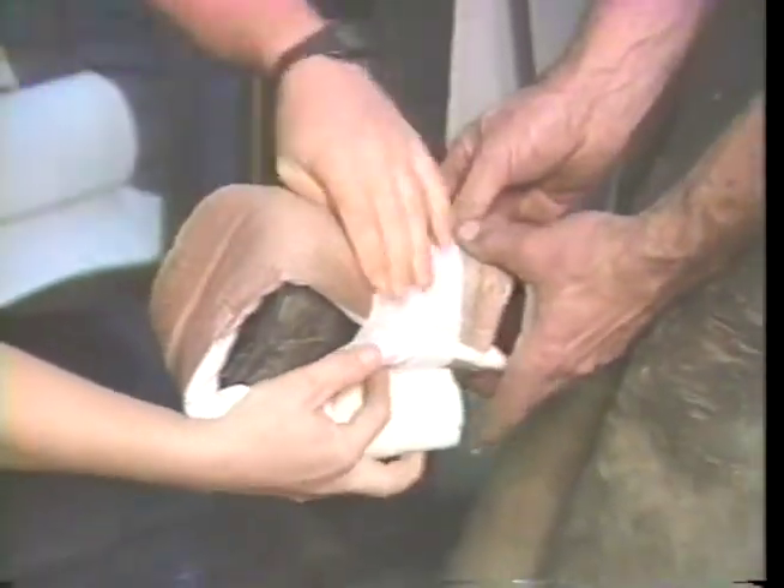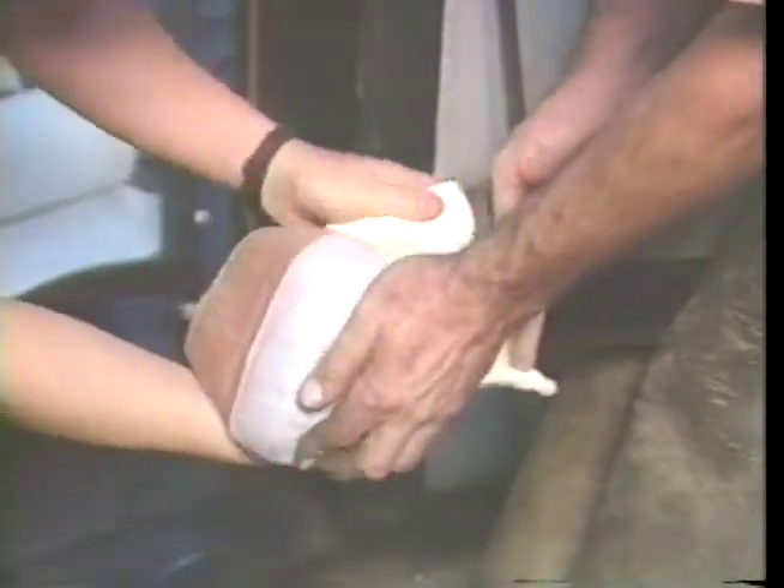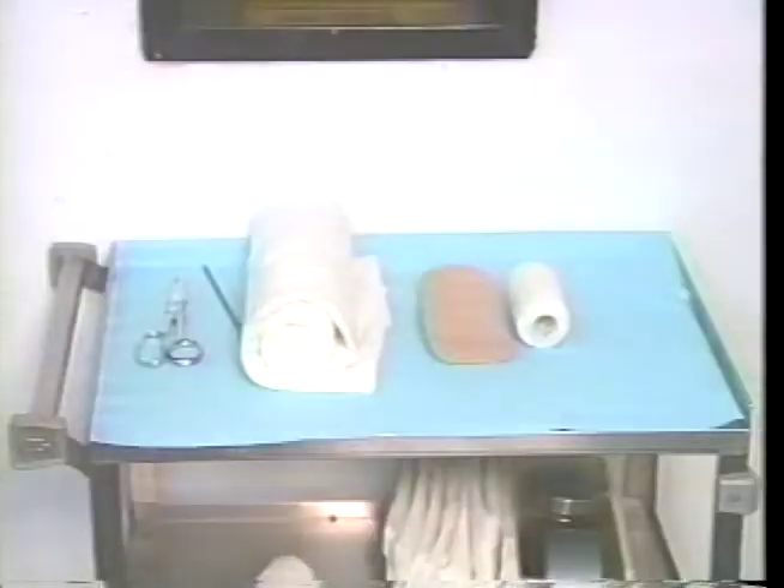So we have a foot that we want to put medication in the sole, put it on the wall — it's got an injury, we want to protect it, whatever it may be, following surgery — this is the basic bandage that we always apply. I prefer to use the Army-Navy bandage, which has now become almost obsolete and we cannot find them anymore, but there are bandages that are similar in nature. You want to cut a bandage that will be long enough to go down the pastern, across the bottom of the foot, and back up the pastern.